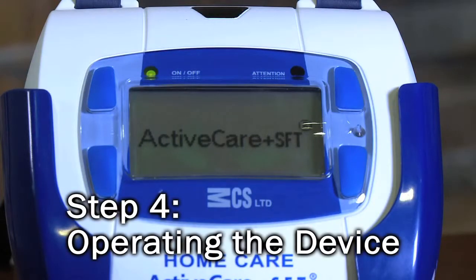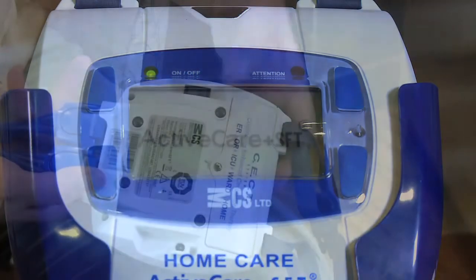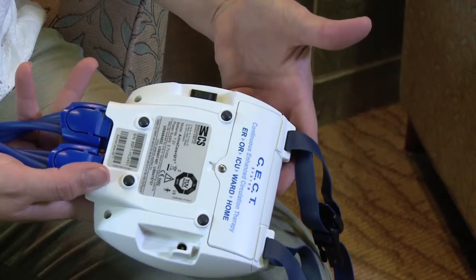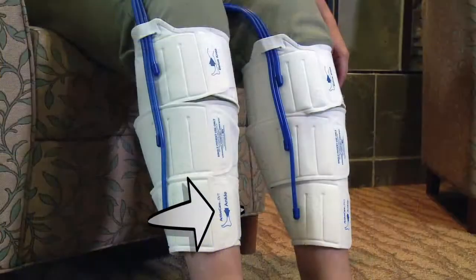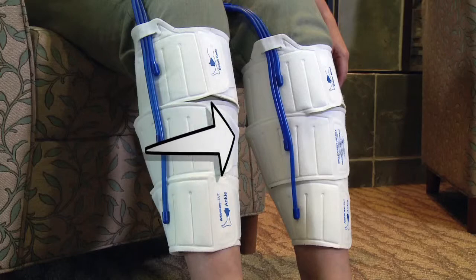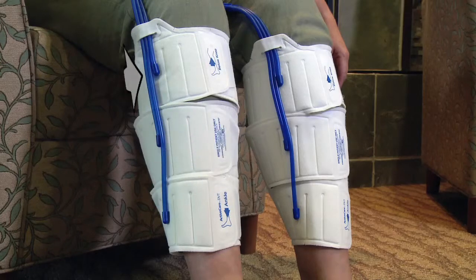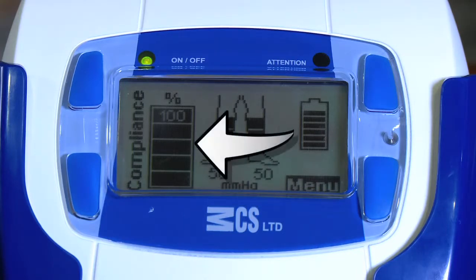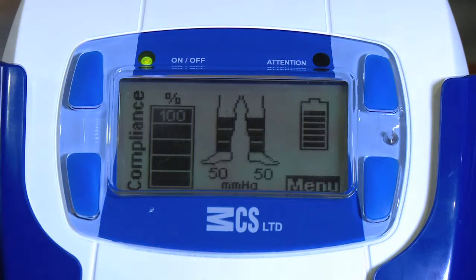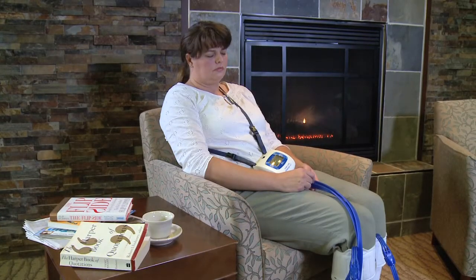Step 4: operating the device. Turn on the power switch located at the back of the device. Your device will automatically select the correct mode of operation, and your sleeves will begin to inflate sequentially starting at the bottom. You will then see the main screen with four options: compliance bar, treatment mode, battery, and status menu. The compliance bar shows you how often you are wearing the device — you should be wearing it almost all the time, even when sleeping.